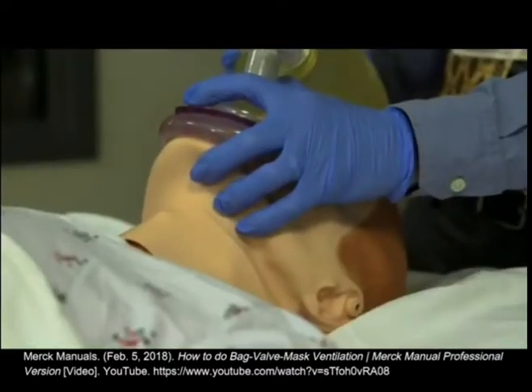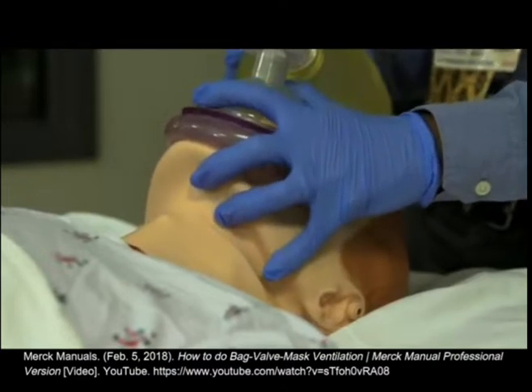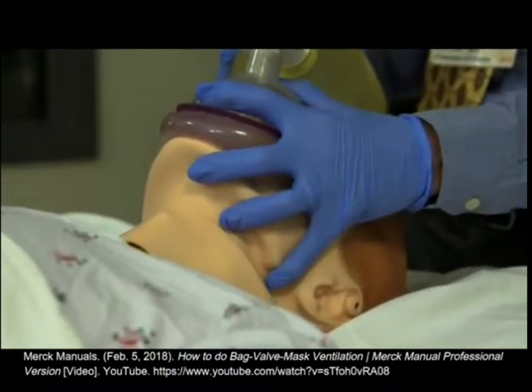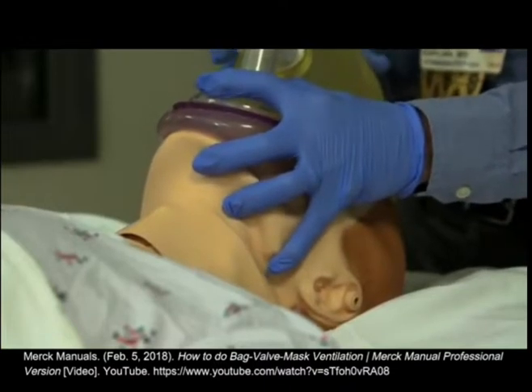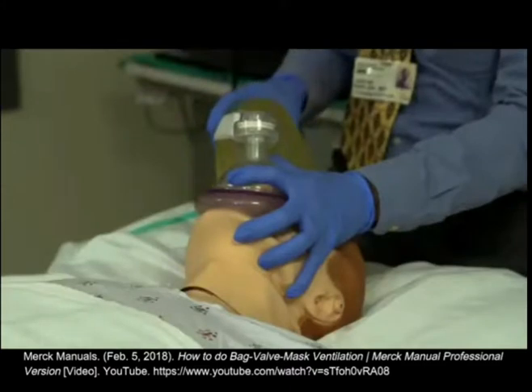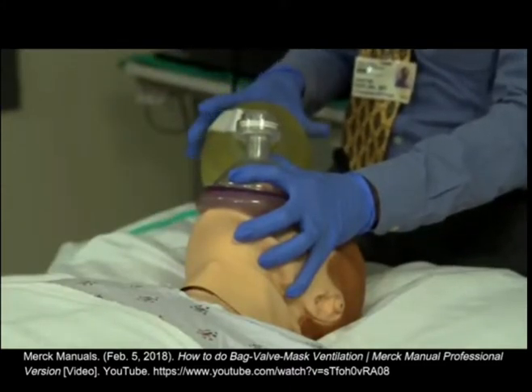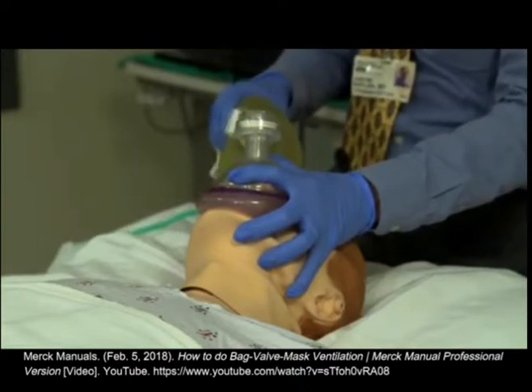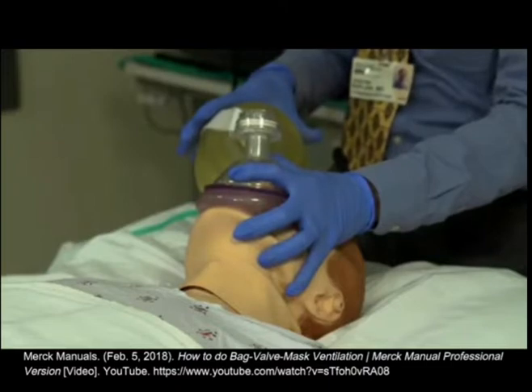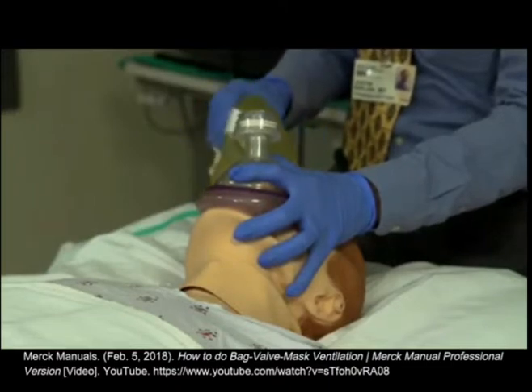If your hands are large enough, your little finger may be placed behind the mandible and do a jaw thrust maneuver to further open the airway. Be sure to pull up only on the bony parts of the mandible. Pressure to the soft tissues of the neck may obstruct the airway. Once a good seal has been achieved, begin to ventilate the patient. In most cases, the ventilatory rate should not exceed 10 to 12 breaths per minute. Use a tidal volume just large enough to cause the chest to rise.